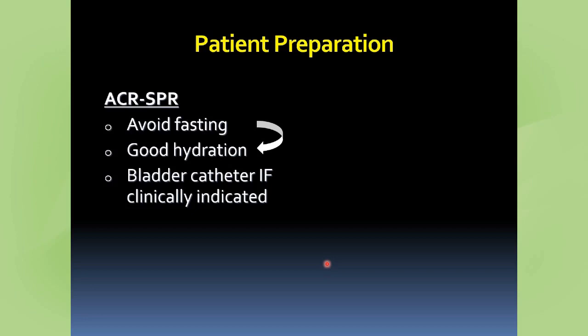And so they want good hydration, because you need to have enough fluid available in your body to respond to that Lasix. If not, it can give you Lasix, but if you're dehydrated, and we see that a lot here at our clinic with our active duty population, especially our young trainees who have a very rigorous training schedule. They're training a lot in the heat here in Texas, and it's very hard to get them pre-hydrated before their appointment, because they'd rather sleep or make phone calls than hydrate.